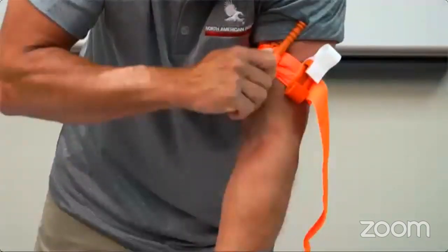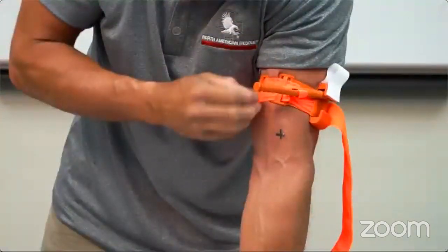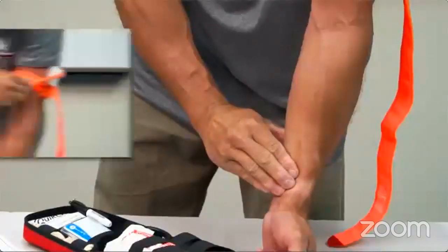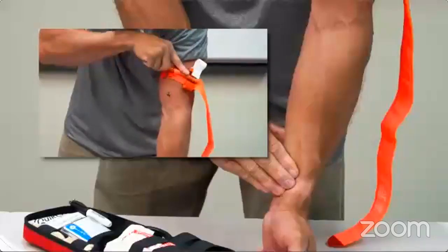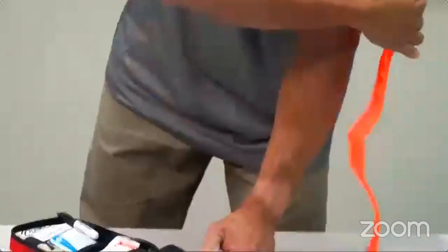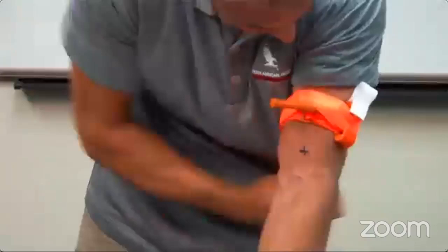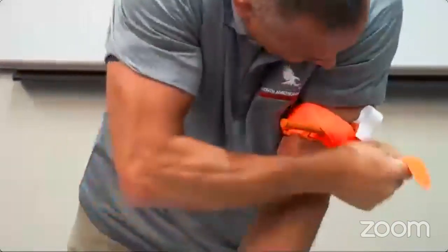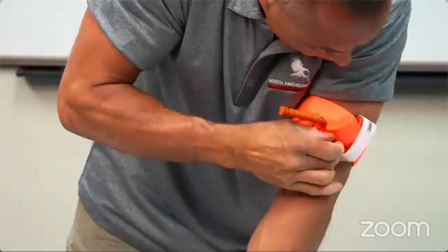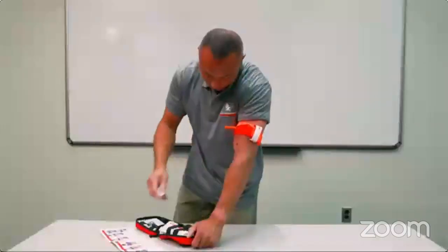Twist the rod until bleeding has stopped. Secure the rod inside a clip to lock it in place. Check for bleeding and distal pulse. If bleeding is not controlled or distal pulse is present, consider additional tightening or applying a second CAT above and side by side to the first. Reassess. Route the band between the clips and over the rod. Secure rod and band with time strap. If able, record time of application on the time strap with the permanent marker included in the kit.